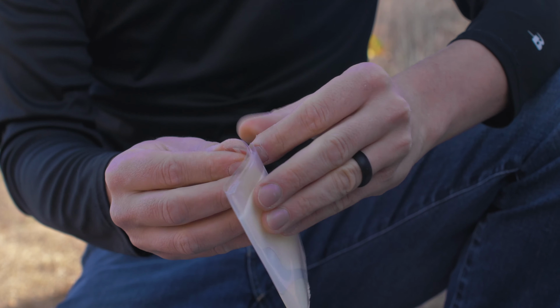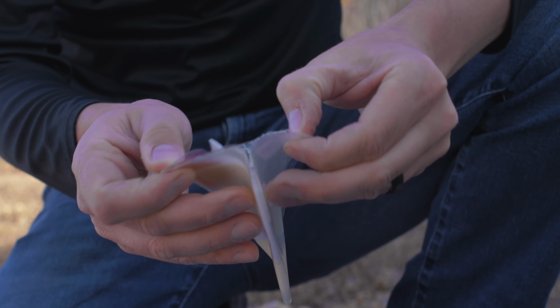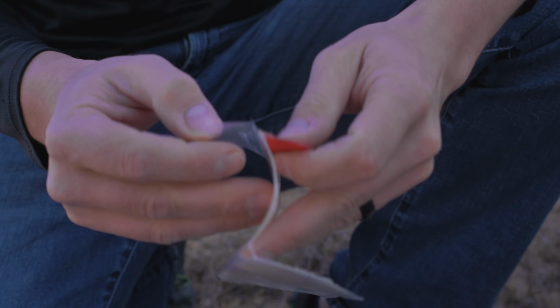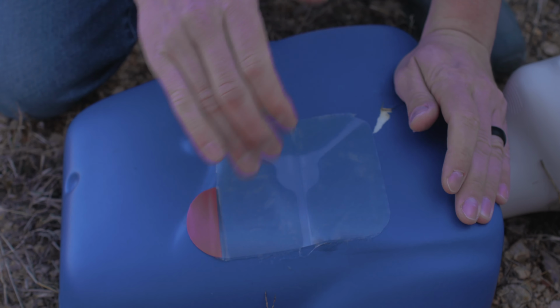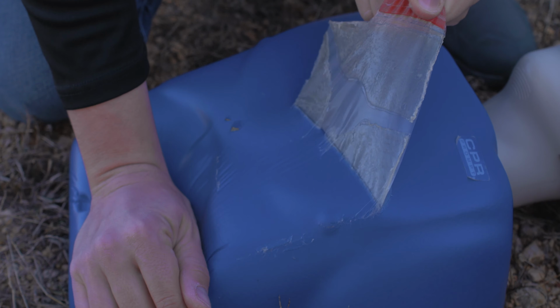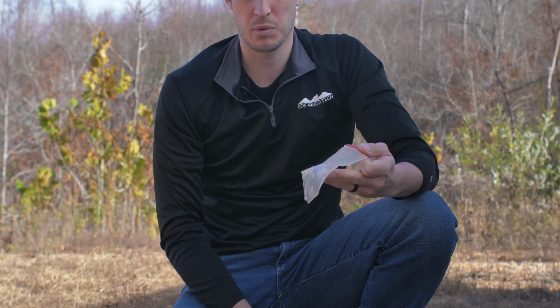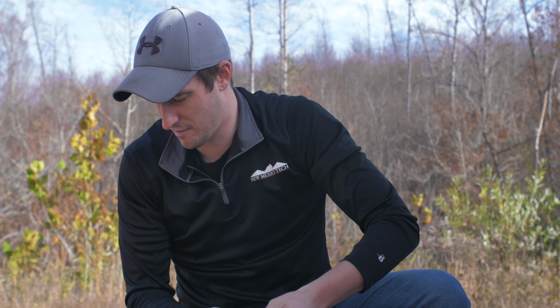All right, so it looks a little more discolored than some of the other ones. Ooh, I went to peel it and it actually peeled off the plastic rather than opening up. All right, get it out, get this off, open it up. Peels fine, no issues. Slap this on. And it seems just as sticky, if not stickier than the other ones that we had. It left more residue than the previous ones that we pulled off from the same time period. I think it's all basically the same. I don't think there's any significant findings here.